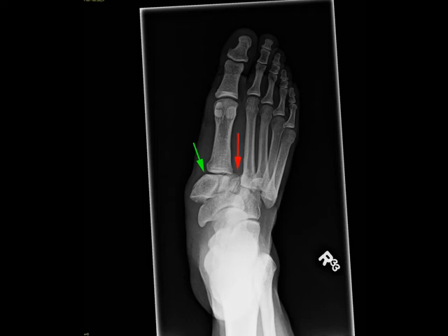This is a patient who presents with foot pain following a motor vehicle accident. Frontal oblique and lateral radiographs of the foot were obtained.